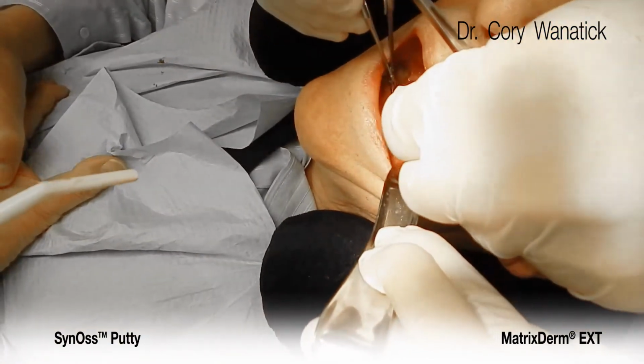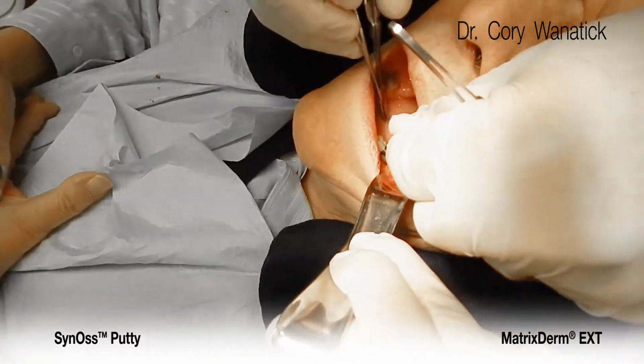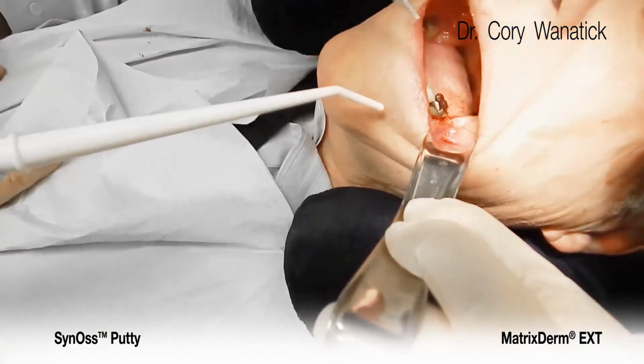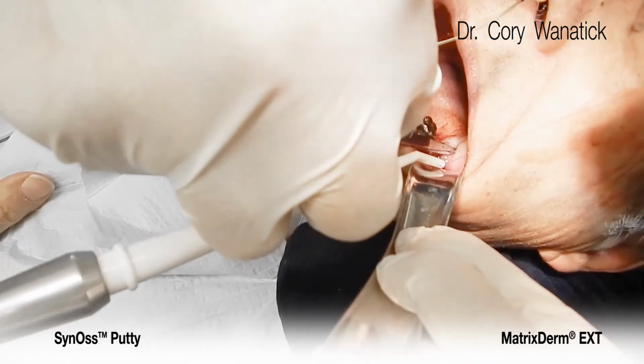As you can notice, we're not getting primary closure, but with this membrane, we're able to leave it exposed to the oral cavity. Patient will be placed on a chlorhexidine rinse, and there should be no ill effects with healing.